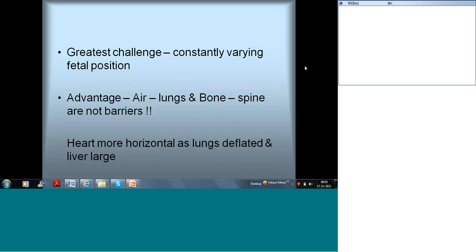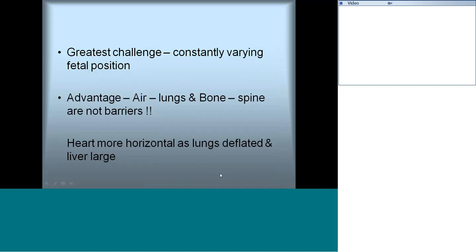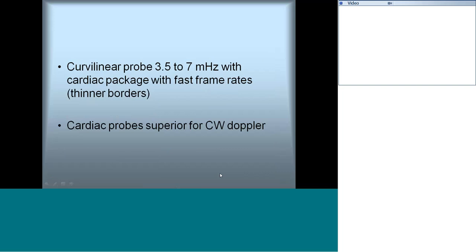Compared to postnatal study, the heart in fetal echocardiography is more horizontally oriented as the lungs are deflated and the liver is large. It is advisable to use a curvilinear probe; we have three probes available — 3.5, 4, and 7 megahertz — with a cardiac package preferable. Cardiac probes can also be used especially for Doppler studies.